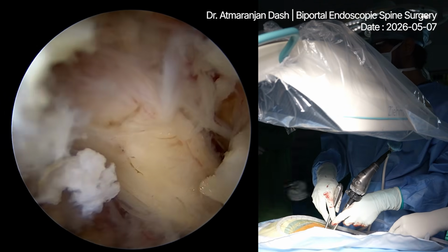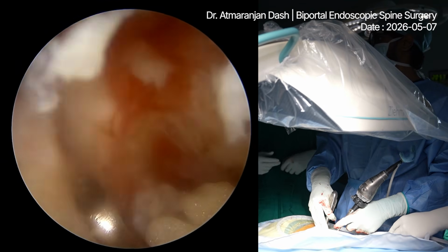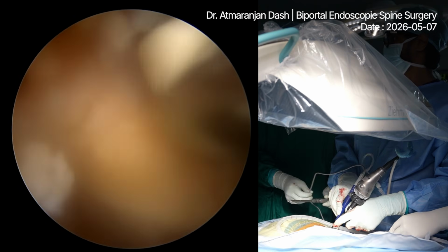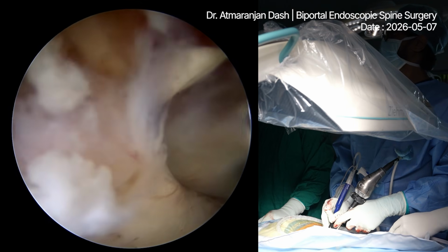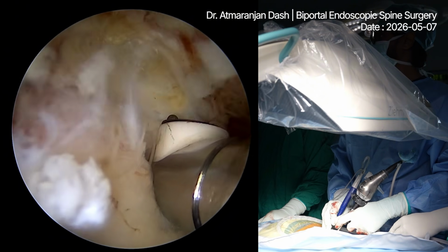Curette hook. Position. Good. Saline. Correct. Good.